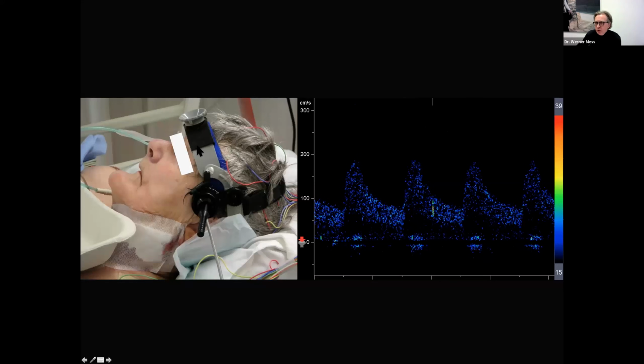Well, slowly but surely we move to the invasive therapy, but not yet. This is after carotid surgery. This lady here is monitored, and I will now start this audio file. It's not easy. I'm not sure whether you heard the embolus in the middle. It's very high frequency, pretty tiny.